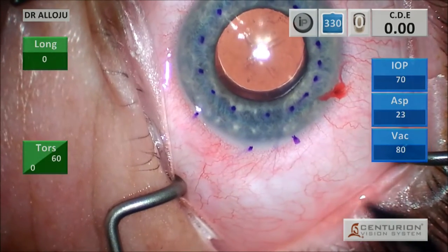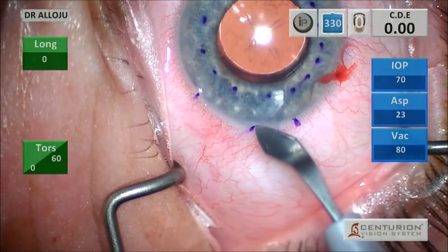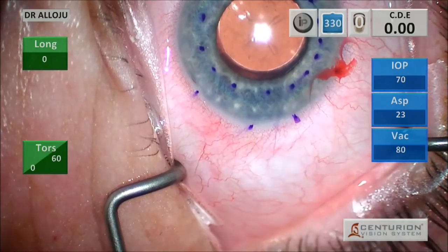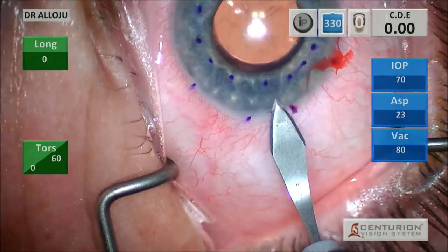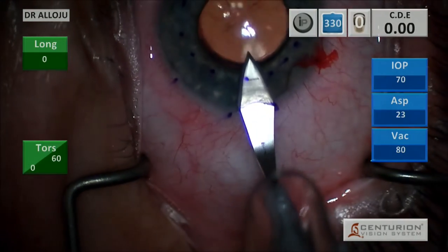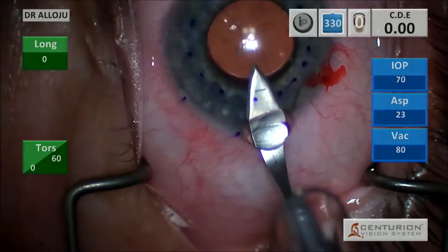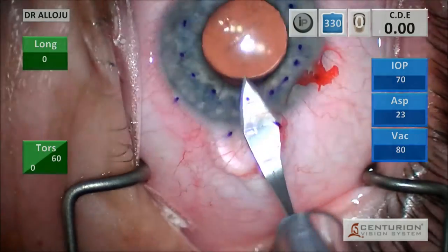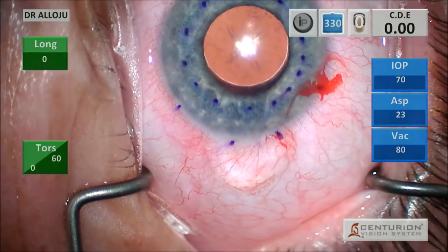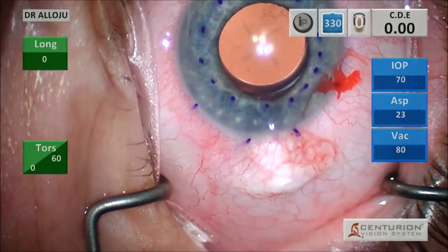I then move on to my incision. I'm kind of making a shelved incision here. We're going to end up suturing this anyways. And I also extend the wound there, making sure it's also nice and open. Gives me more maneuverability.